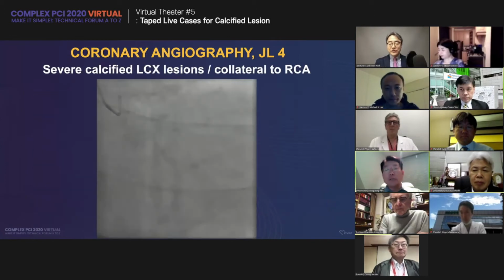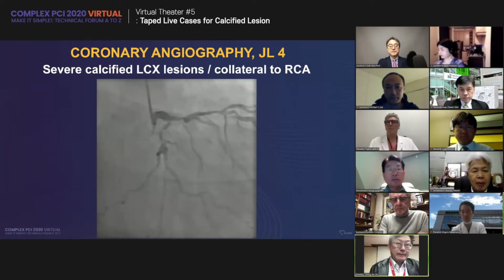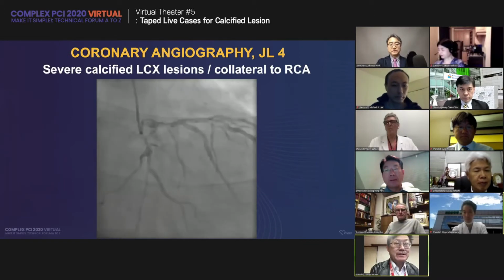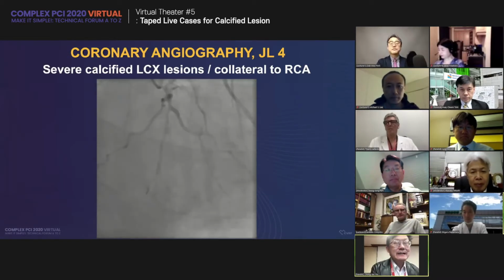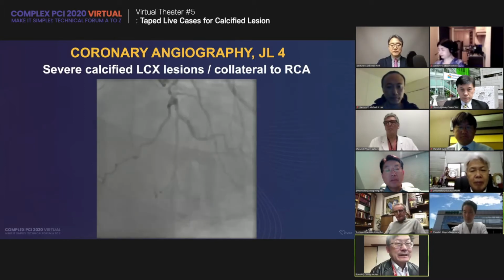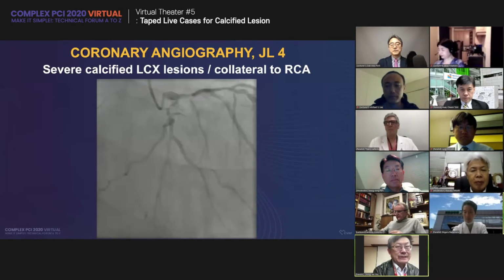Okay, Dr. Wu, any other suggestion? I think the difficulty, my point, is probably the anomalous RCA. I would like to treat the RCA first.